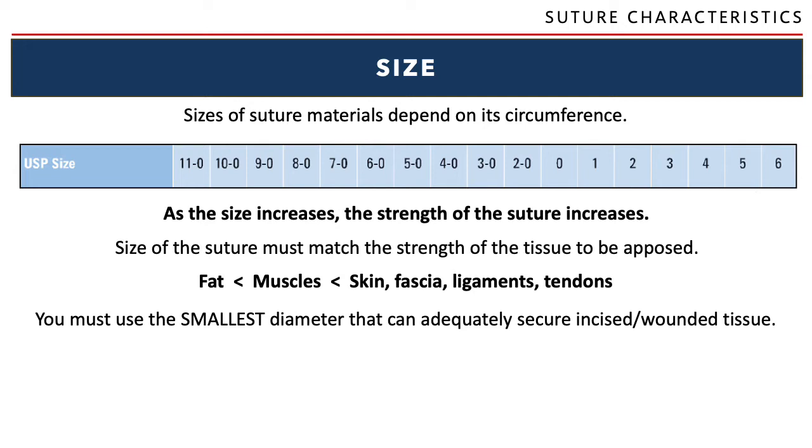Now here is where your experience of other vets would be beneficial, because it takes experience for you to know if a certain size of a suture is enough or if it is inadequate in opposing tissues. Like for example, a 3/0, okay? A 3/0 is good enough to suture skin of a cat. And it is sometimes even good to suture skin of a small dog.